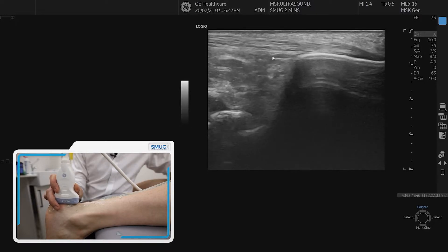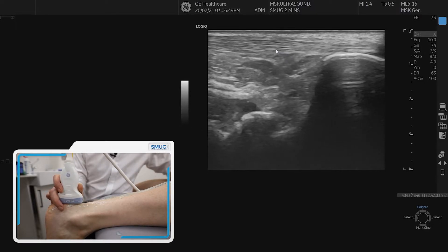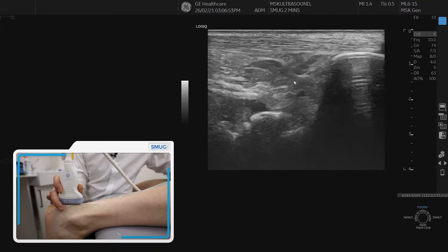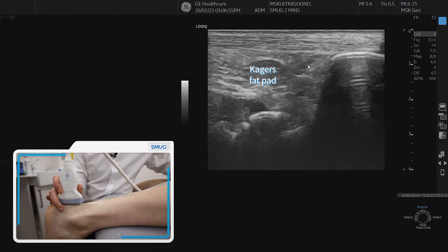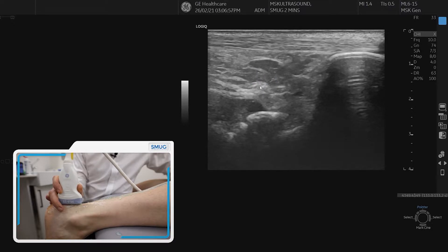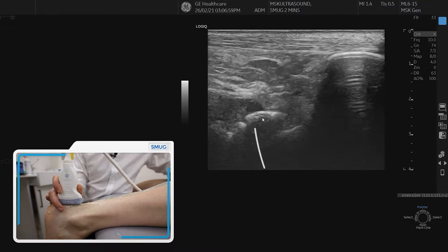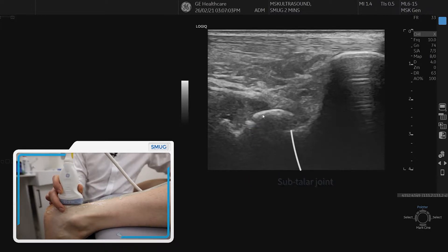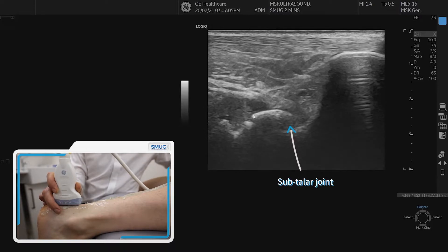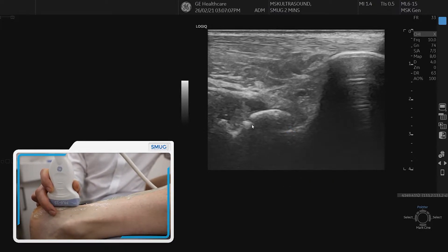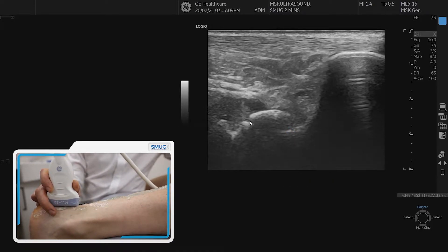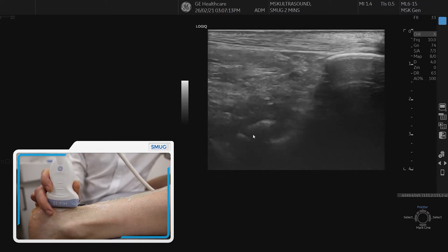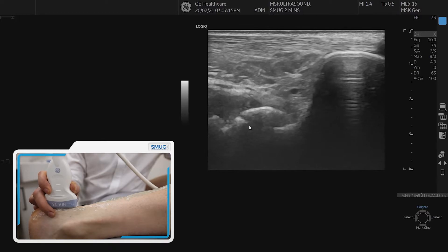As we move more proximally we can see the Achilles tendon. Underneath the Achilles tendon is the Kager's fat pad. In this demonstration, beneath that is the subtalar and talocrural joint, and there is an os trigonum at the posterior aspect of the ankle joint. Moving the foot into plantarflexion and dorsiflexion can provide information about the posterior aspect of the joint.